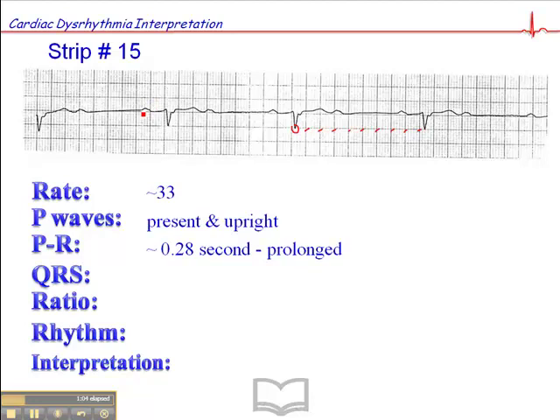Now you notice, and this is a key factor here. So here's the beginning of the P wave. There's the beginning of the QRS roughly. So it's definitely a prolonged PR interval, but if you look at this PR interval you'll notice that it's consistent with this one and it's consistent with this next one, and if you review more of the ECG you'd see that the PR interval is consistent, and that's a very important finding.